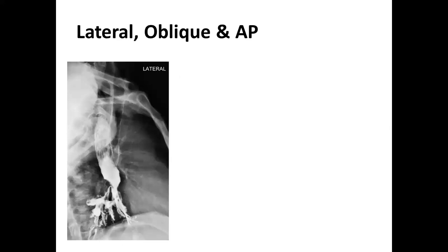So this is the lateral chest of the patient after giving the patient contrast. Unfortunately, the patient was given barium sulfate because there was no obvious suspicion of contrast aspiration. So this is a lateral barium swallow examination. We can appreciate the contrast taking good shape of the esophagus.